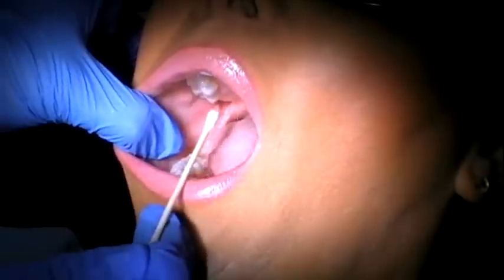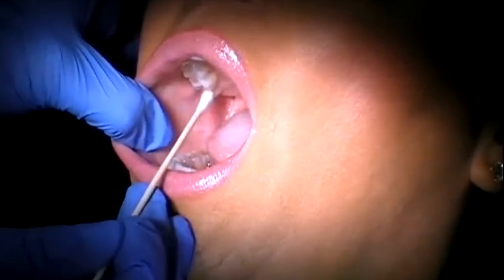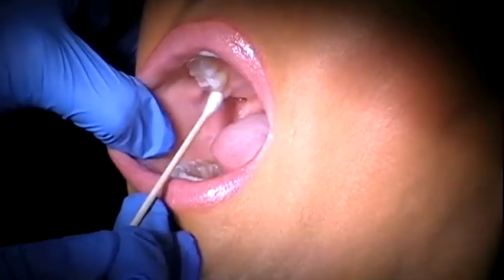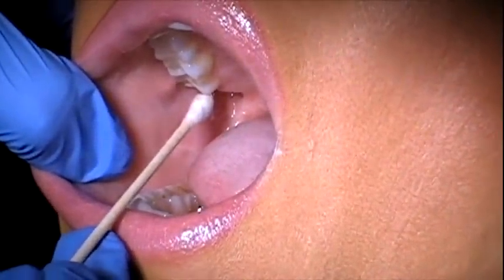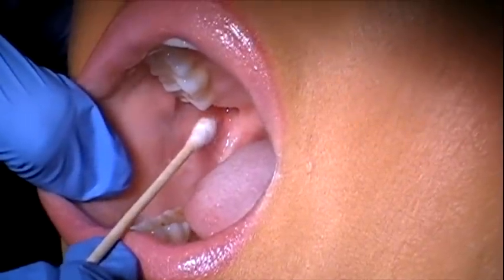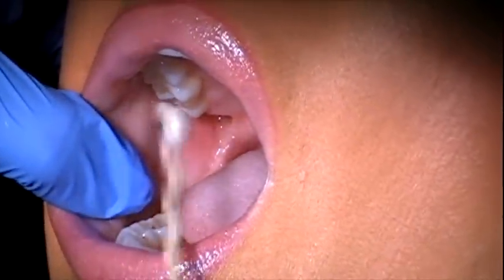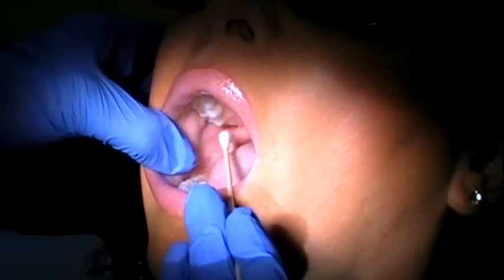The other landmark is the mesiolingual cusp of the second molar — that gives you your height. So your injection site is going to be just distal to that molar at the height of the mesiolingual cusp. The barrel is going to be coming from the opposite premolar, similar to the IA injection.